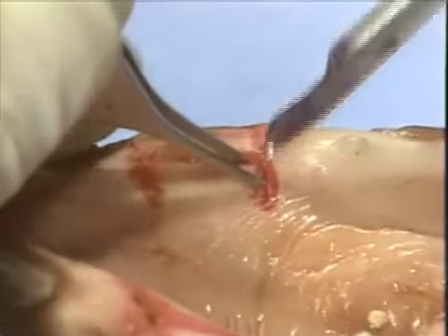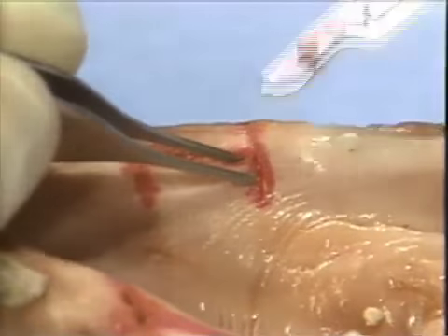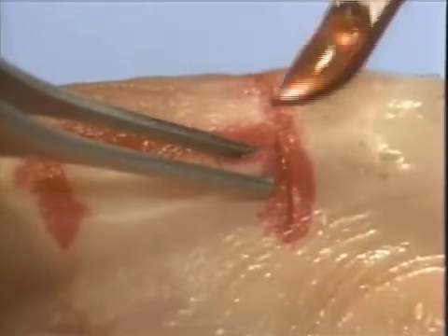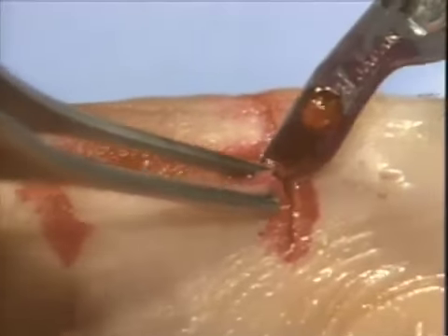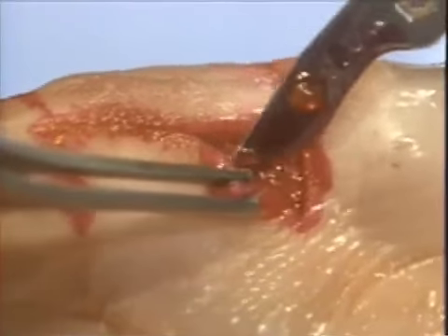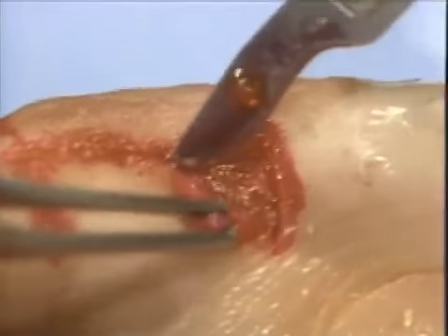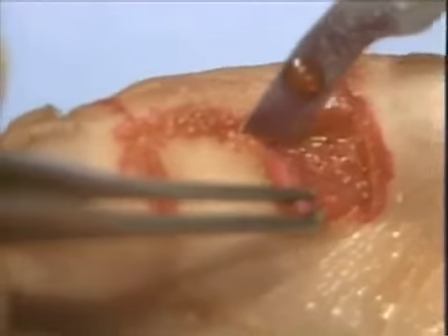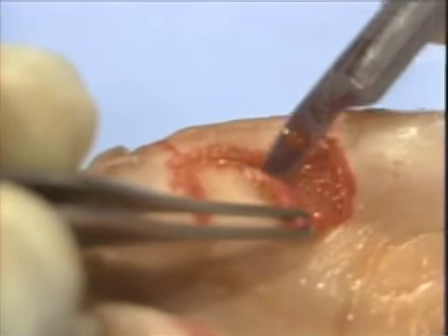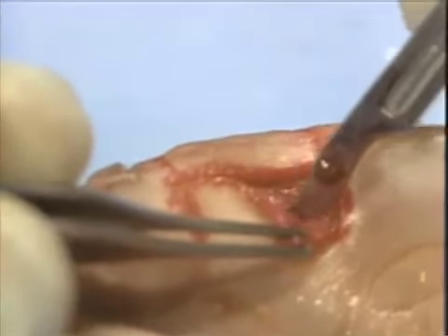Your assistant can elevate the flap with tissue forceps using gentle tension. This allows visibility for the operator to gently and atraumatically undermine the lingual flap, using care not to perforate the flap and to maintain an adequate thickness of tissue.